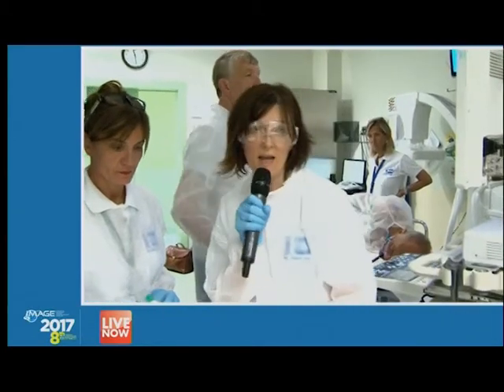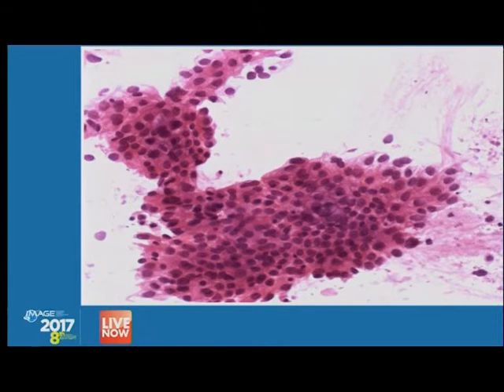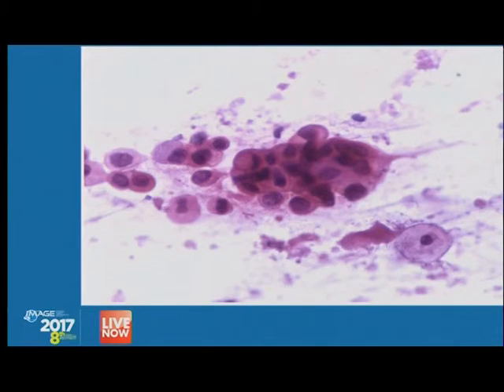On the second slide, you can appreciate a lot of cells. These pathological cells, they are malignant cells from adenocarcinoma. I hope you can see here. And even in a major enlargement, we can see on the third slide the cells. So you can see pathological adenocarcinomatous cells. So even if this is just a cytological specimen, it's very good for diagnosis.